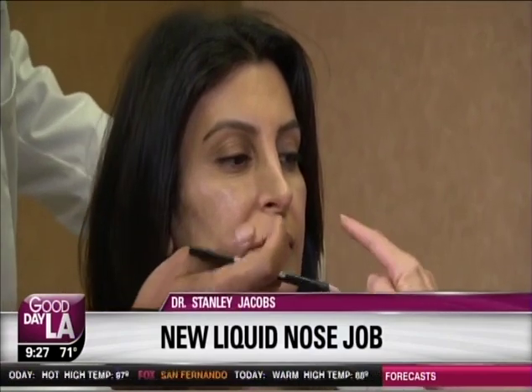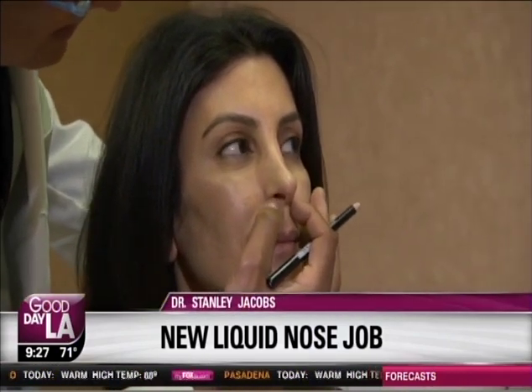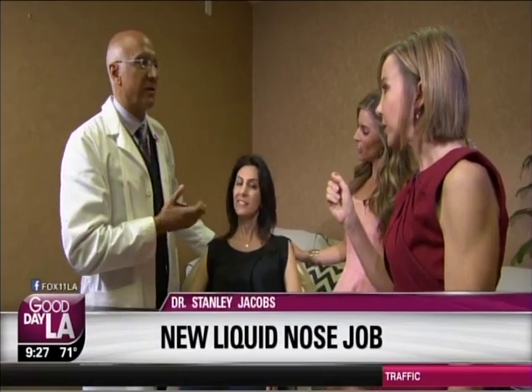But you also want to put a little bit in here, so we want to have this effect down here. See how that lifts that up? That will lift the nose. And that's the anti-aging part, because this angle between your nose and your lip is, right now, 90 degrees. You raise that even a few degrees, you lose like 10 years. Okay, so your nose can age you? Yes. I had no idea. One more thing to worry about. As it droops, you can lift it up, and that's what's going to be great.